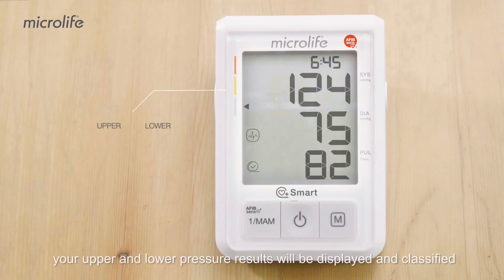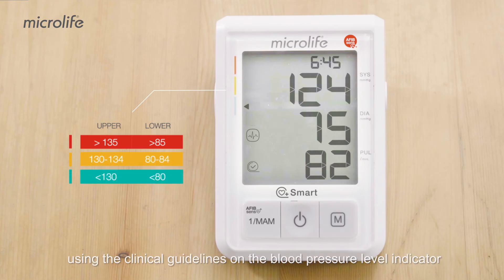When measurement is completed, your upper and lower pressure results will be displayed and classified using the clinical guidelines on the blood pressure level indicator.